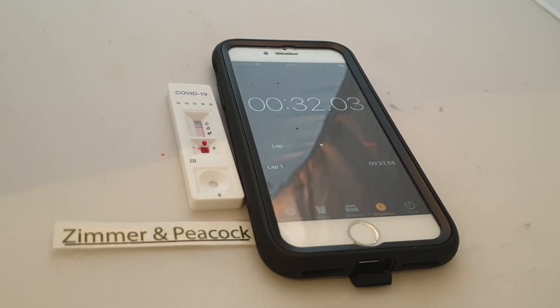The control is basically a color change, and that tells me that the device itself is actually working. I should read this — I'm tracking the time so that I'm not going to, you know, interpret the results after 15 minutes, because after 15 minutes you shouldn't be interpreting the results.